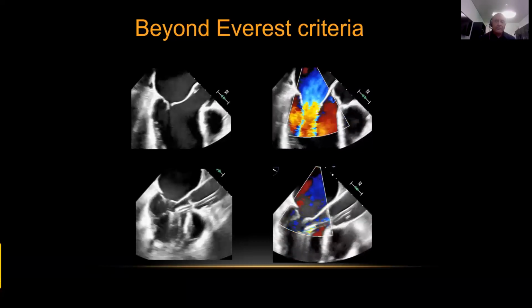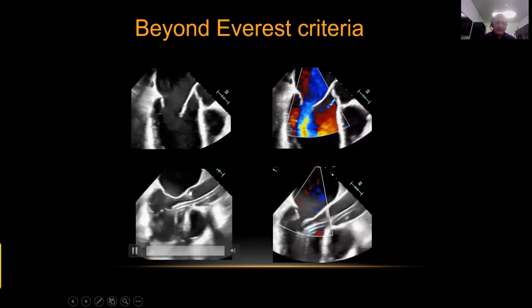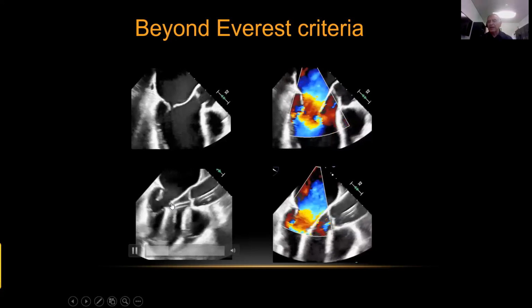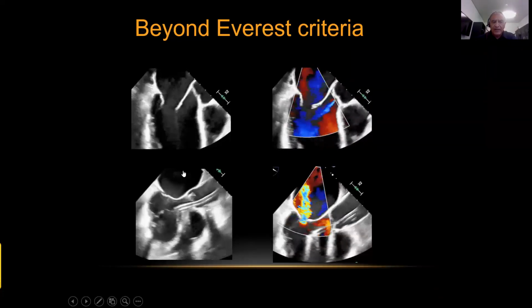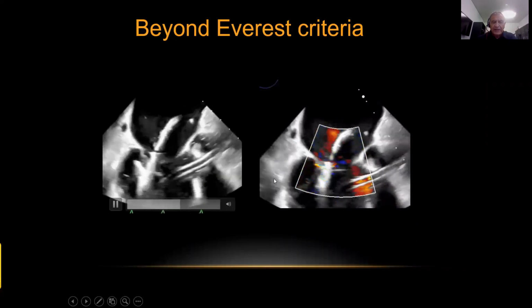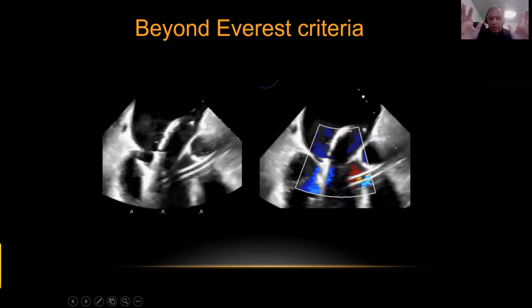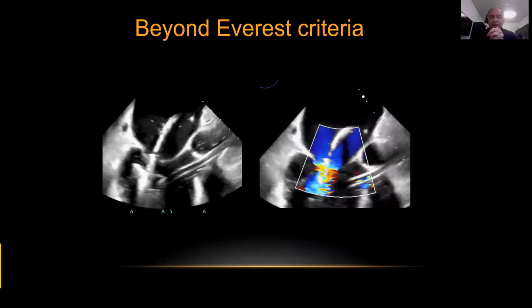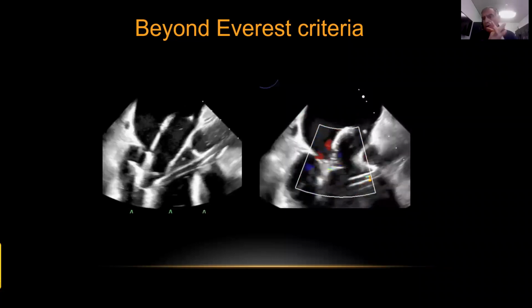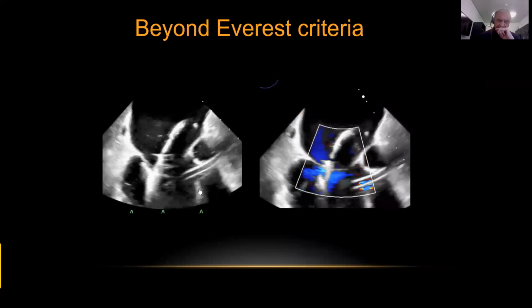At the beginning, my concern was whether the catheter of the impeller could interfere with the grasping of the clip, but as you can see here, they do not interfere, and the clip was closed. So in other words, there are no cases of functional mitral regurgitation that cannot be done with MitraClip. No cases at all. This is my first message that I can give you.